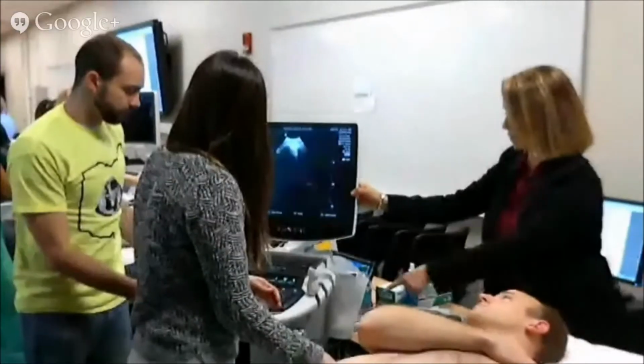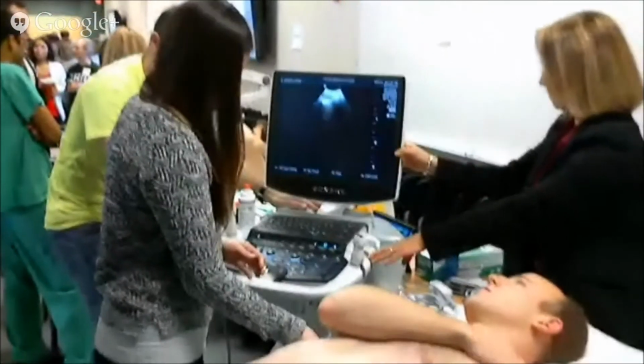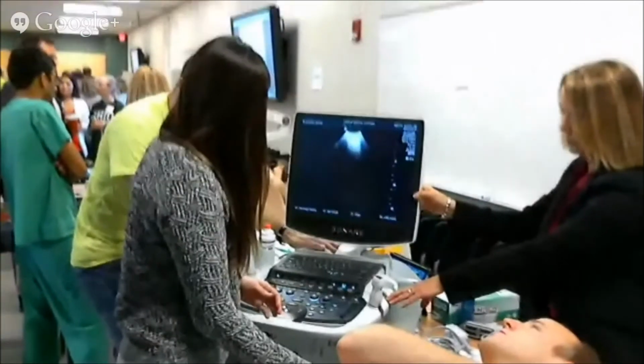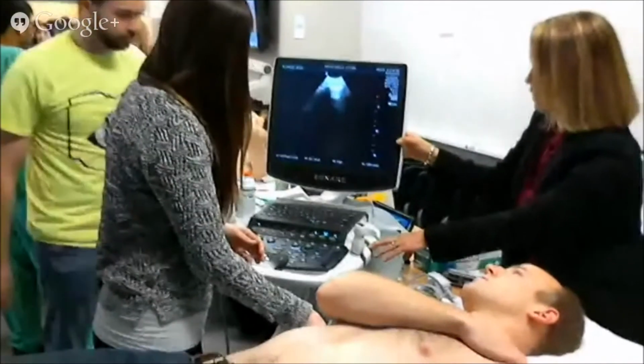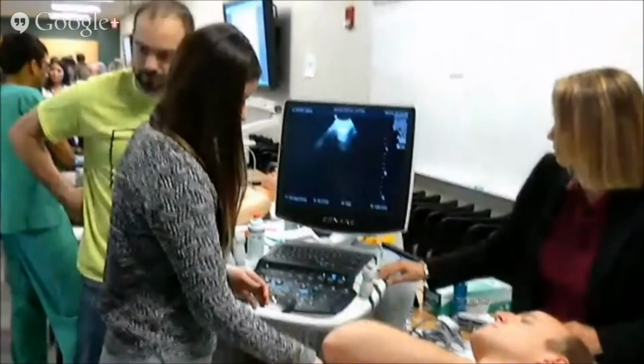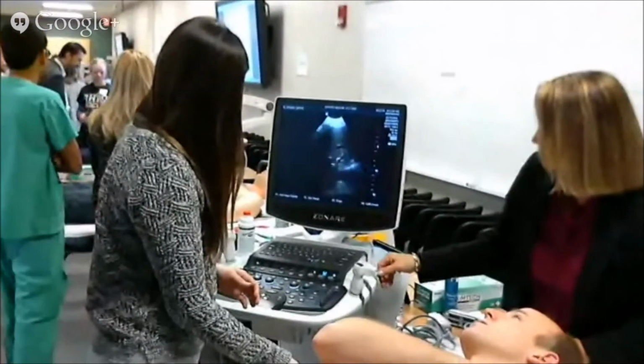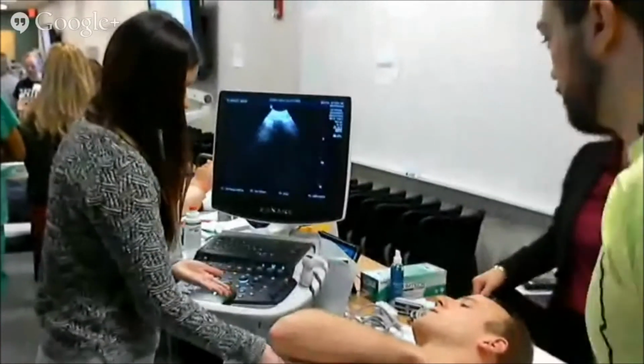You just push that red button on the bottom by the wheel and lock it. Press harder. Now you need to push. It's hard, because you want the surface to be flat against the patient. Slide around. That's called longitudinal. Cool.